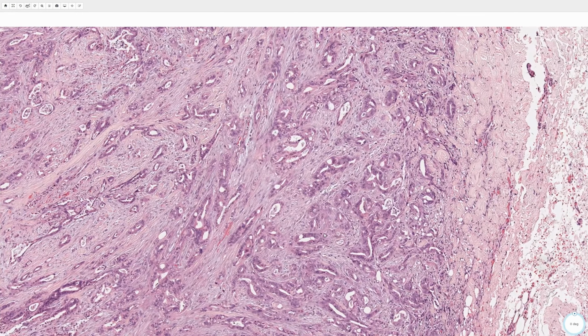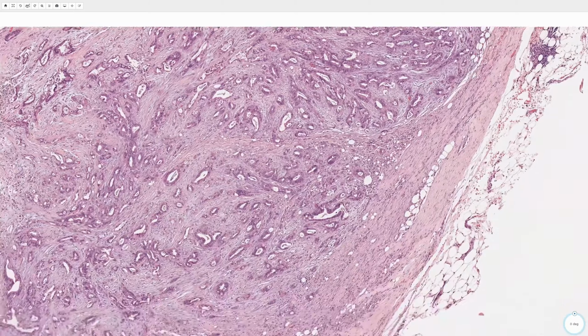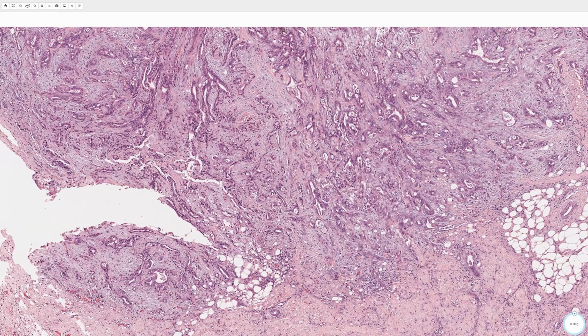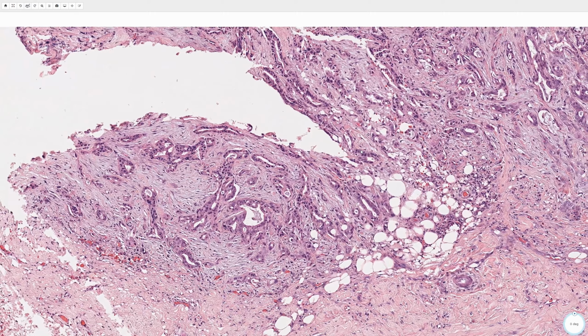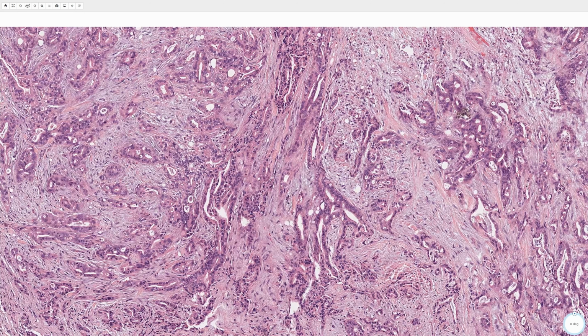Here, the glandular structures are small and maybe embedded in more of a fibrotic stroma, and they don't have that same tubulovillous arrangement that we saw in the colonic lesion. There's somewhat of an edematous myxoid fibrous stroma, and these relatively well differentiated islands of tumor here with some signet cells and creating these little glandular tubular structures. Here we don't see quite as much of that neutrophilic debris within the lumina. And these will stain with CEA and also CK7.